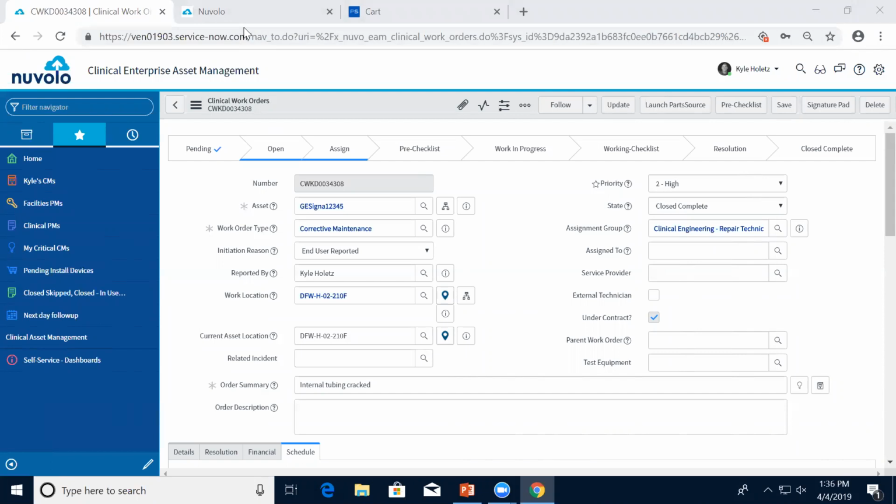We have a technical team on our side that is going to call into technical support, wait on hold, listen to the disco music until they get somebody. And the way that it works is you can either start it through the mobile application by clicking request a quote, take some photographs and submit it through. Or if you get through the catalog, we start the punch out through Nuvolo, we can't find our item.